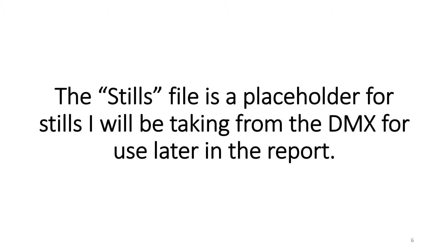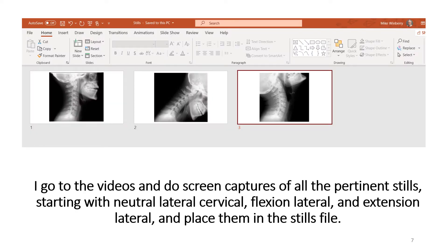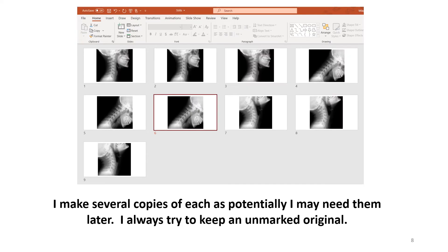I open up the patient's stills file. As I read the film, I do screen captures, which I can highlight and embellish with word tools, and PowerPoint gives me a place to keep them for later use. The first video I work with is the flexion-extension lateral projection. I make screen captures of the neutral lateral cervical, a maximum flexion lateral, and a maximum extension lateral. I make several copies of each of the lateral captures and always try to keep an unmarked original.